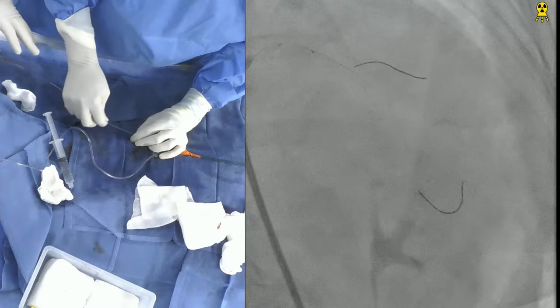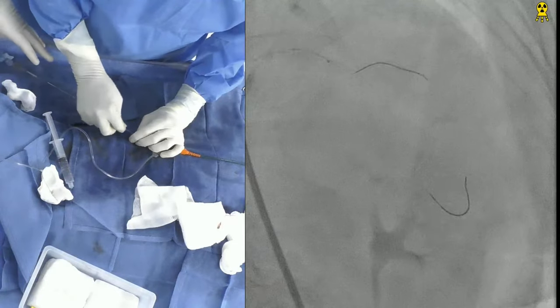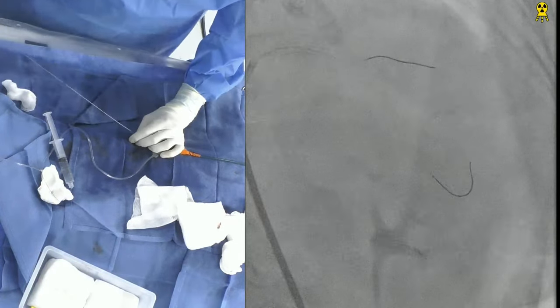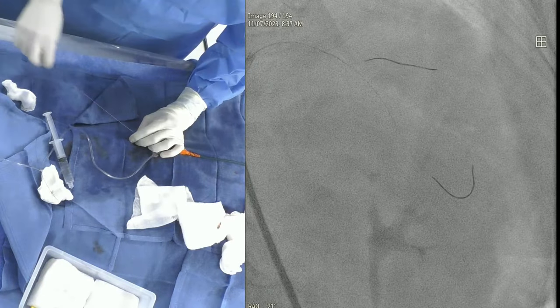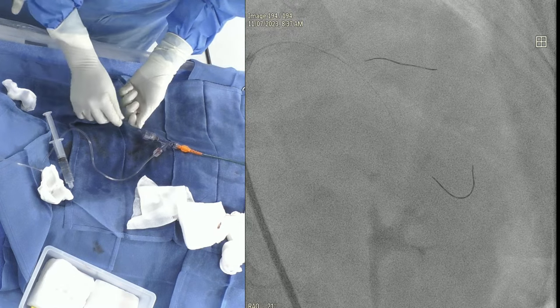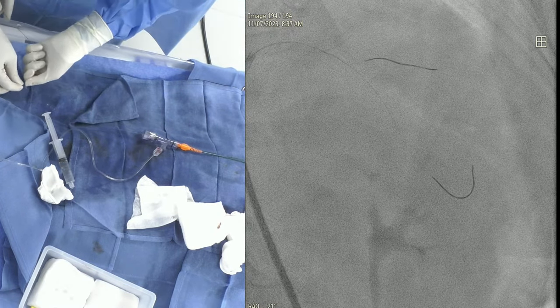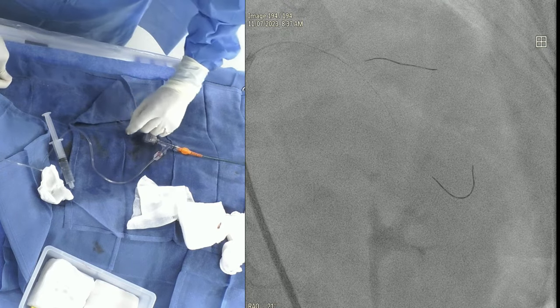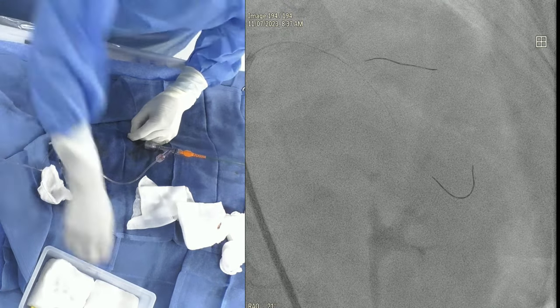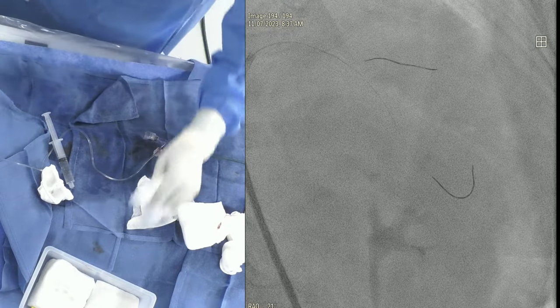We can get a 2012 compliant first. Yeah, but it's very angulated, it will not go. Leave it. No, that's not the thing. Finally, the wire got through. So a 2012 compliant balloon. Get me the pink. Wait. Euphora, right? No, what I would do, get a regular run through. Also, the wire has been twist turned. Yes.